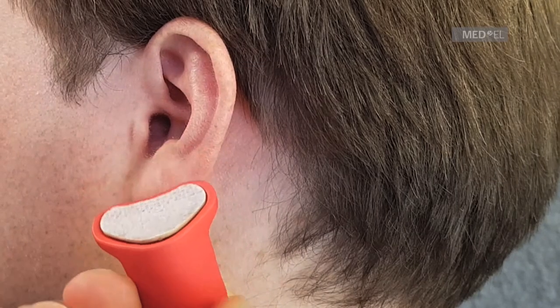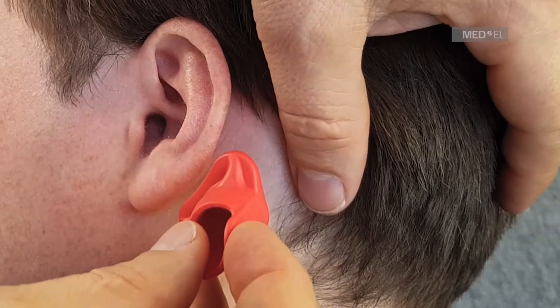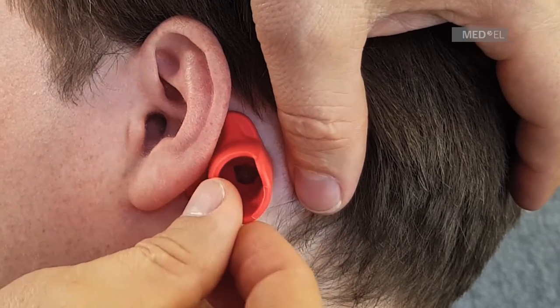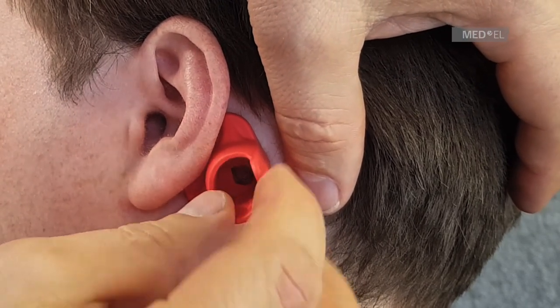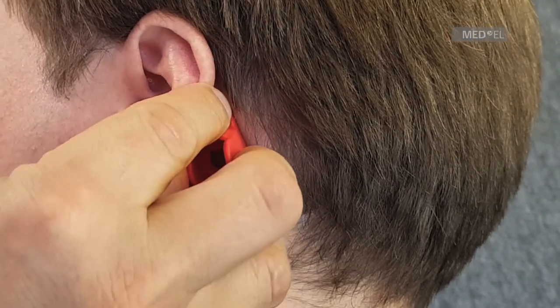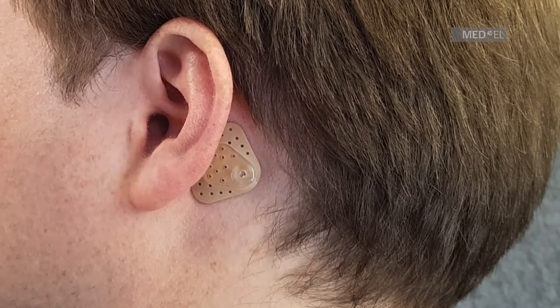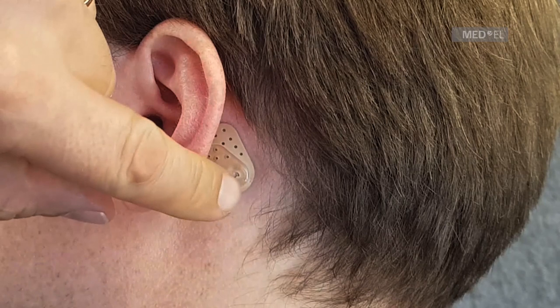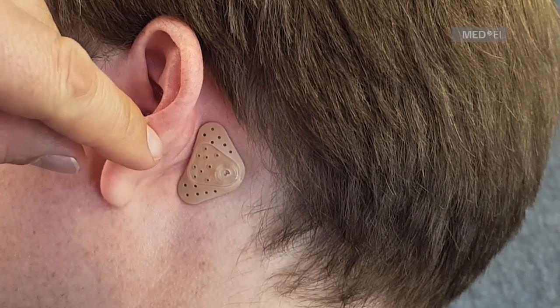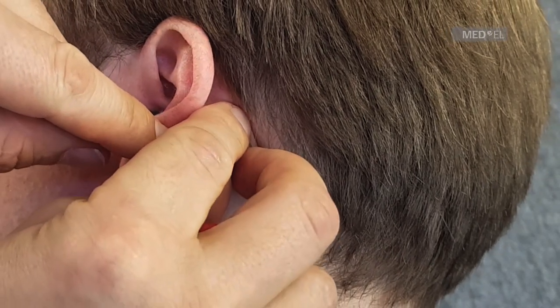Make sure that the skin behind the ear is free from hair, and move any hair away from the area. Hold the positioning tool so that it is touching the ear, with the adapter placed over hard bone. Press the tool down firmly. Gently remove the tool by moving it straight upwards. Take care that you do not pull against the adhesive adapter when removing the tool. Press down firmly on the entire surface of the adhesive adapter for at least 30 to 60 seconds.